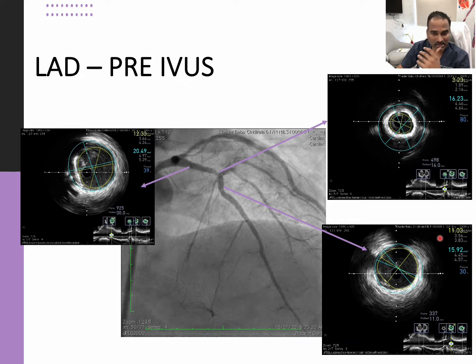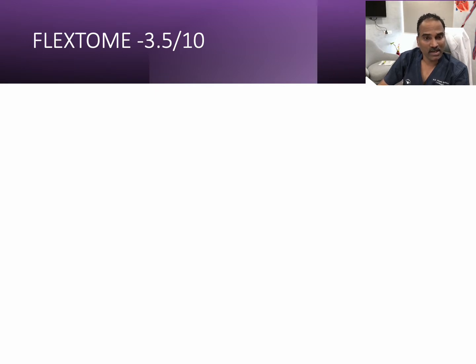So it's clearly more than 70% area stenosis with a 2.9 mm square MLA. In such a situation, when I have to go retrograde, I would always address this lesion before going retrograde. Otherwise, we may end up in hemodynamic compromise during the course of the procedure, and the procedure will go unpredictably.